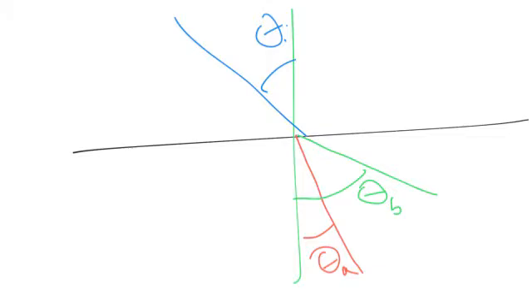Yeah, question? Would you annotate that you have that going on? So she asked if I would annotate that I saw critical angle artifact or loss of signal due to that. No, I wouldn't, because anybody reading these images better be smart enough to look at it and go, yeah, of course, that's refraction error. You've lost signal due to refraction.